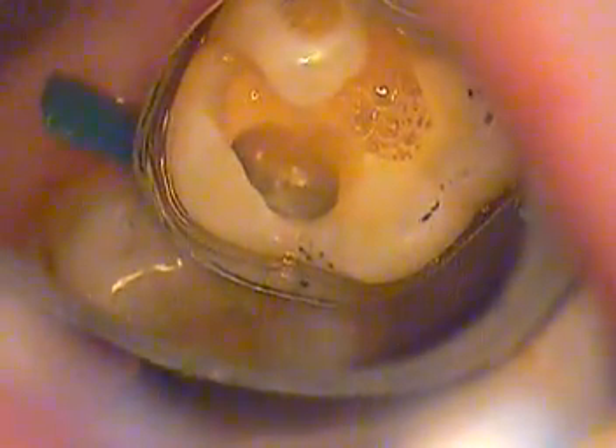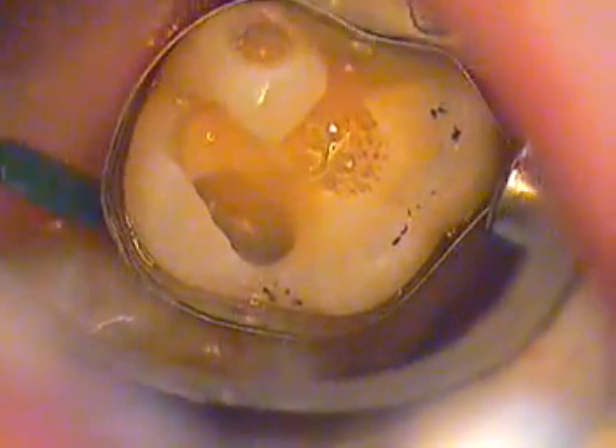I've gone with plastic wedges here. The mesial contact is going to have to be held — going without any tines — basically this is a very large buildup and we've got to keep the gingival area very precisely sealed. That's our first attempt; we'll probably end up mixing two mixes of core paste.